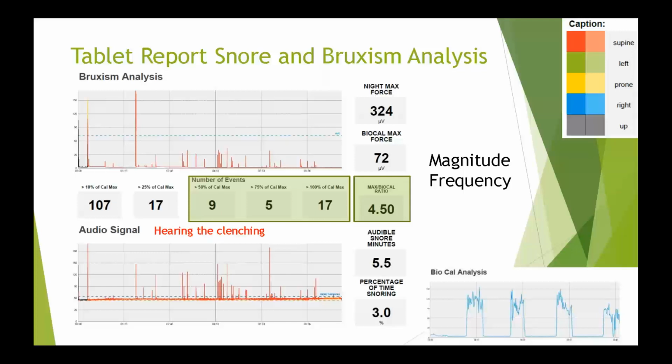Bruxism, I use bruxism when there's a significant amount of parafunction and it's not related to the airway, or we suspect that it's not related to the airway because the SpO2 and the snoring are normal. Yet we see a tremendous amount of bruxism, which is the case here. So we have a patient that's their airway is fine, tremendously worn teeth, and profound bruxism.